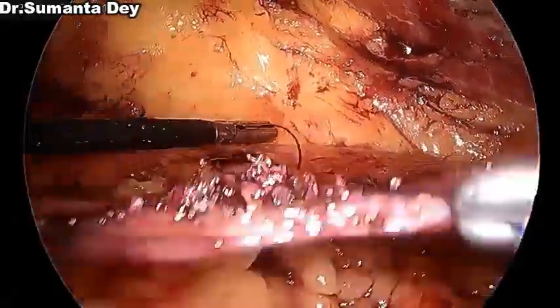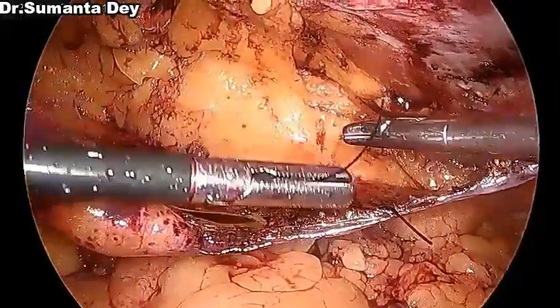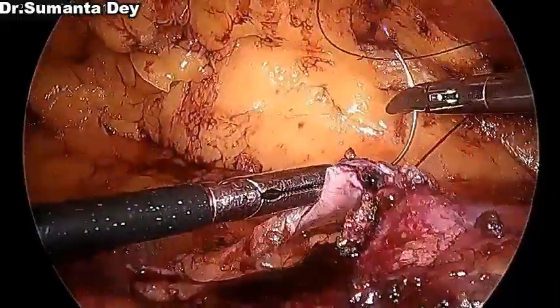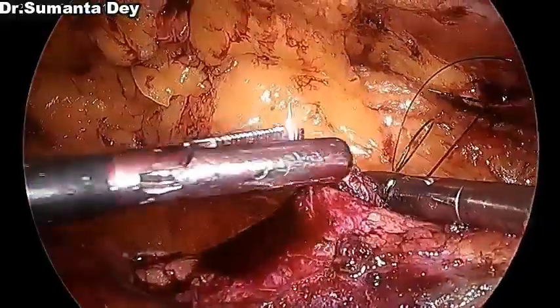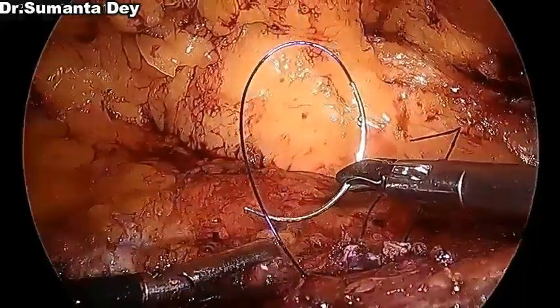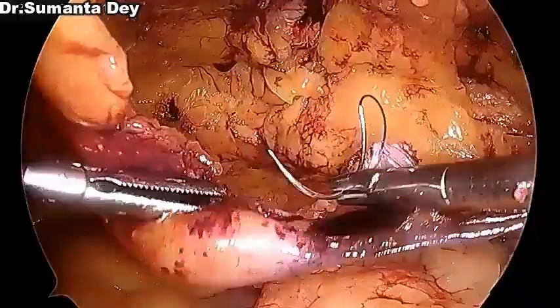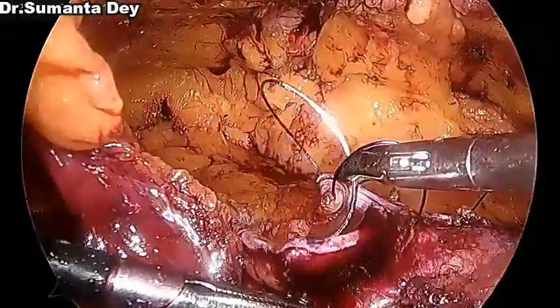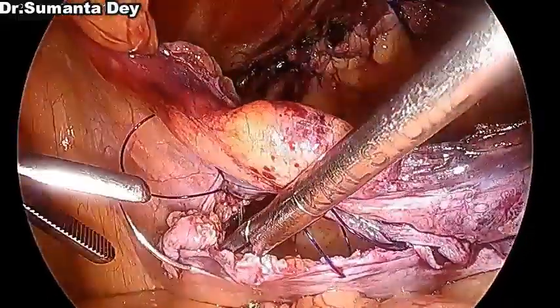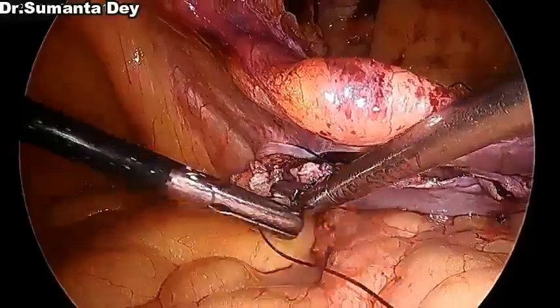After closing the hernial defect, now I am closing the peritoneal rent, and I am using a simple 2-0 PDS suture. PDS in this case is very handy, because handling PDS is very easy. It will pass smoothly through the tissues. Initially I used to close it with V-Loc, but after starting the closure with PDS, I found it very useful. Now I routinely close the peritoneum with 2-0 PDS.